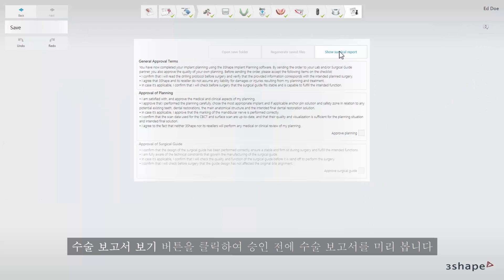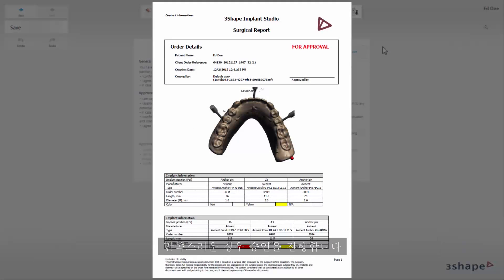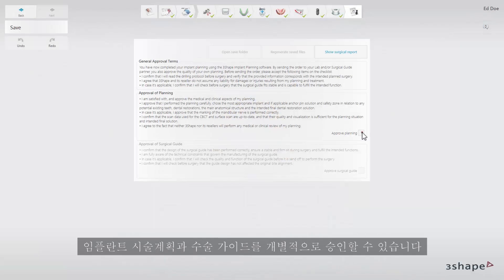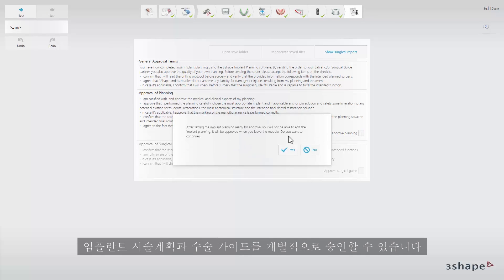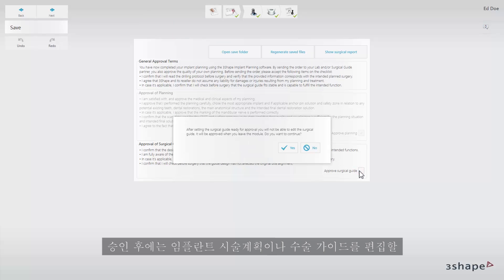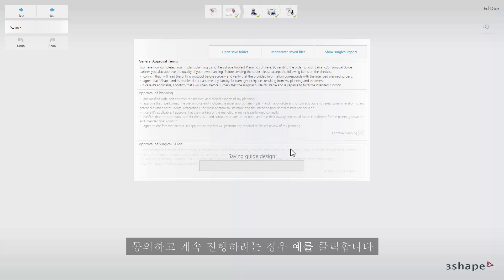Preview the surgical report before approval by clicking the show surgical report button. If you are satisfied with it you can proceed to the approvals. You can approve the implant planning and surgical guide individually — click the corresponding check boxes for approval. A warning message will appear informing you that after the approval you will not be able to edit the implant planning or the surgical guide. Click yes if you agree and wish to proceed.